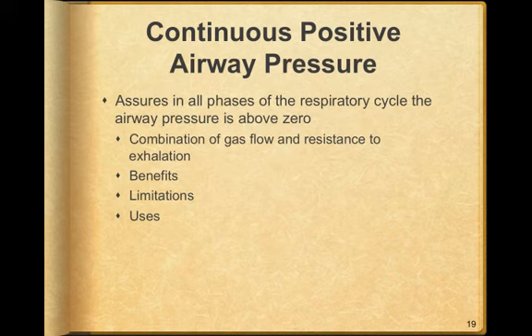Limitations are it does not provide any kind of positive pressure ventilation, no difference in gas flow between inhalation and exhalation. The effects are limited to the alveolar and small airways, and CPAP has been used in various situations, including COPD, asthma, any kind of pulmonary edema at all, and it's relatively simple to use.